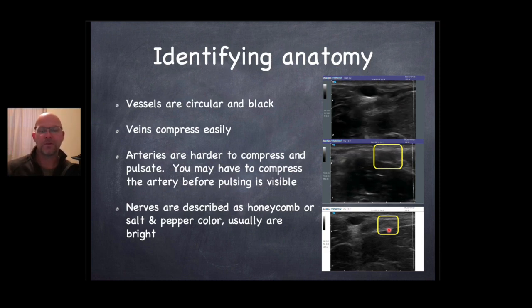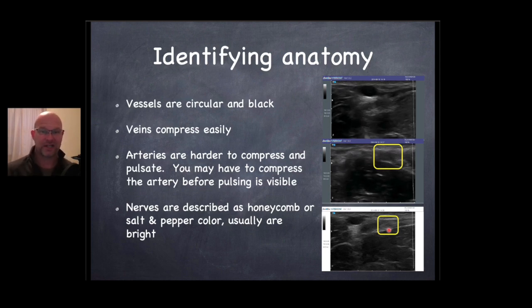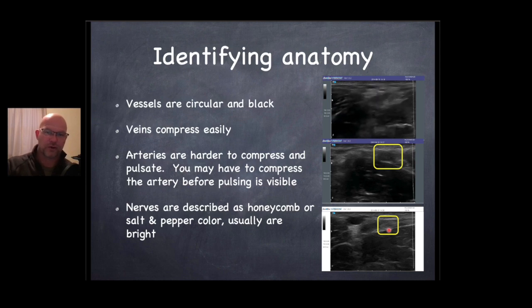I've had that before. And that's the one where you find out all the lies or the fallacies that we as nurses have said for years and years when we miss an IV. "The vein wouldn't hold it. I don't know why that blew." But when you go and look with an ultrasound, you see why. You see that was actually a 90-degree T in there, and what you thought was a good vessel, you went right through it. You may have hit an artery because they can actually corkscrew around that, and at one point it's the artery on top, it's 2 centimeters up, it's the vein on top. So you learn those things when you use ultrasound.